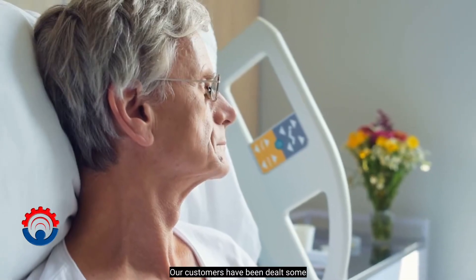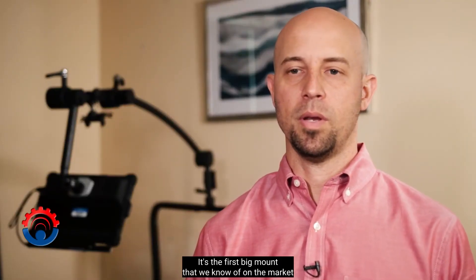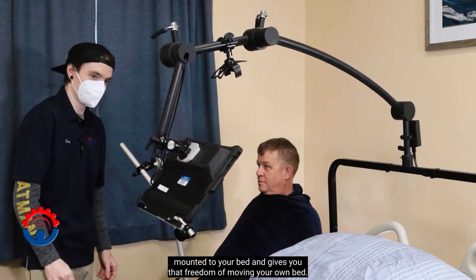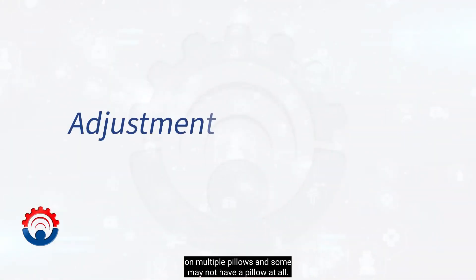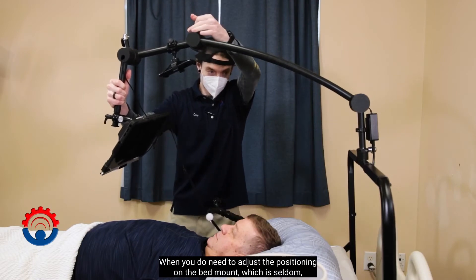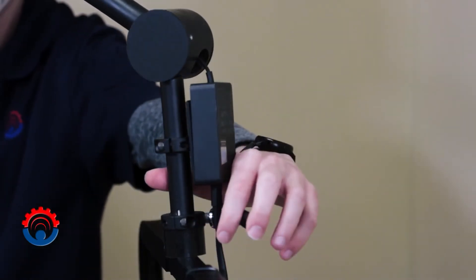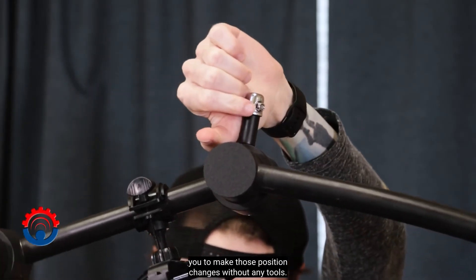Our customers have been dealt some of life's biggest challenges and we want to help ease their burden. It's the first bed mount that we know of on the market that holds a tablet mounted to your bed and gives you the freedom of moving your own bed. Some patients are going to be propped up on multiple pillows and some may not have a pillow at all. When you do need to adjust the positioning on the bed mount — which is seldom — we have a couple of different articulation points so we can adjust it in relation to the patient, using quick-shift levers that allow you to make those position changes without any tools.